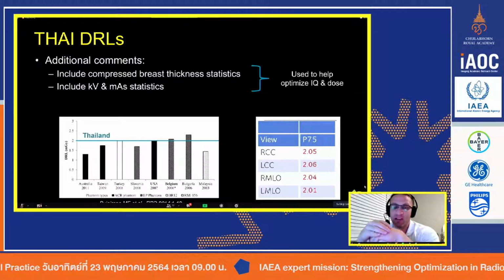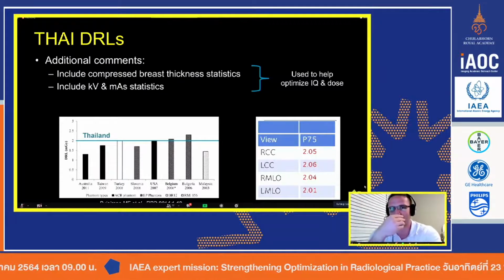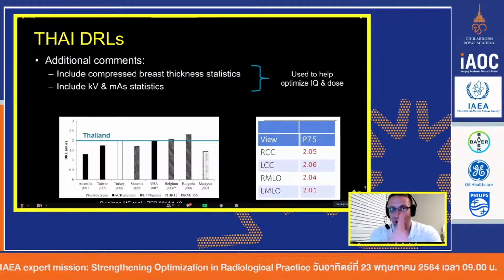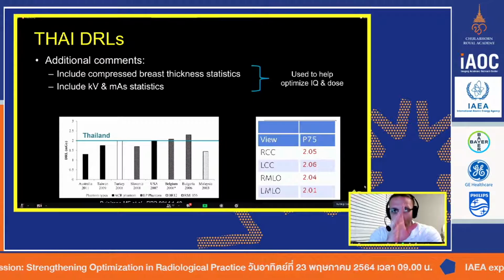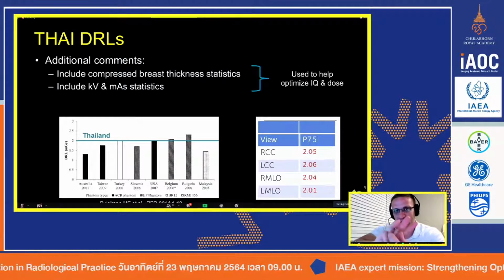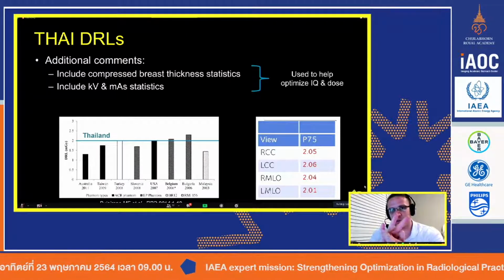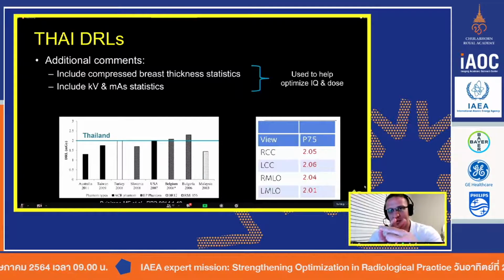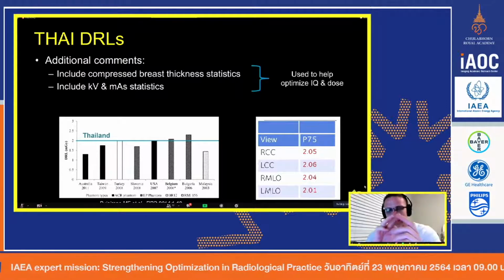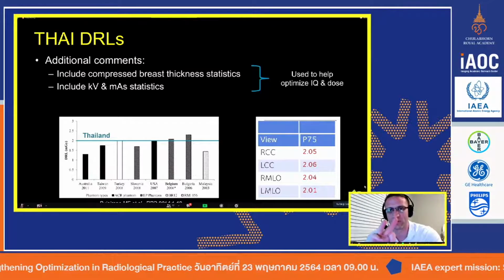Yeah. So you call it the combination of the future, but I would argue it's actually here now. Most modern mammo units, if you go buy one right now, almost all units will sell a tungsten target. And then it'll come with a rhodium, a silver, it might even come with an aluminum filter. And then you would set up your protocols based on whatever you're doing. You'll use your aluminum filter almost exclusively for DBT, for your tomosynthesis. But the rhodium and the silver, depending on the breast thickness, is probably what you would use for your filter.